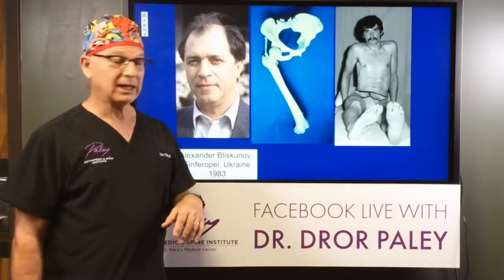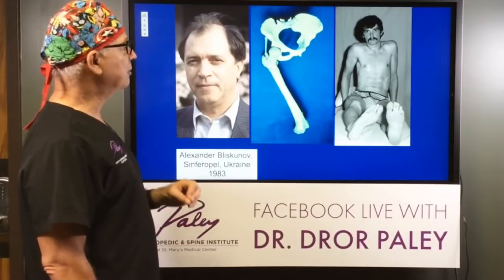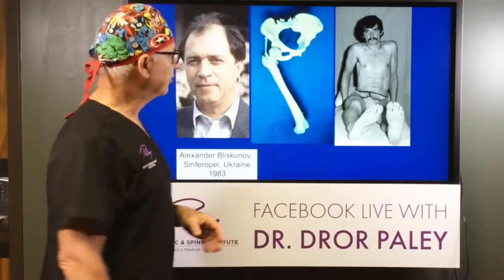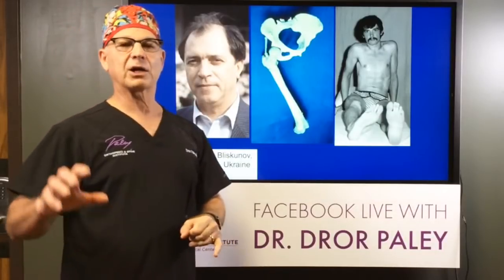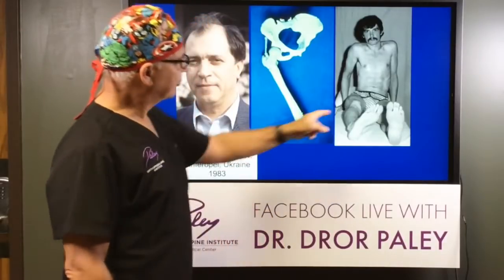Imagine on the one side you've got Ilizarov in the Soviet Union doing these incredible things with external fixators, and on the other hand you have this guy who's doing a futuristic type of lengthening, at the time considered heresy, with an internal device. He was way ahead of his time in 1983.